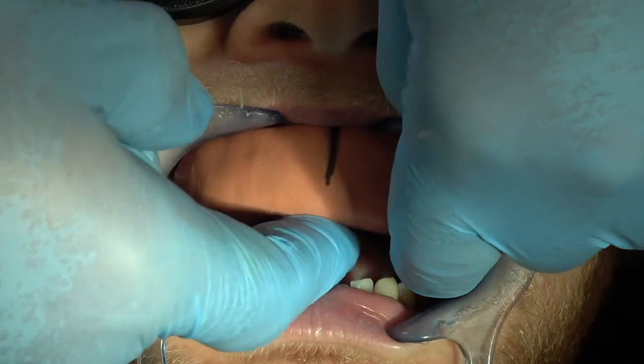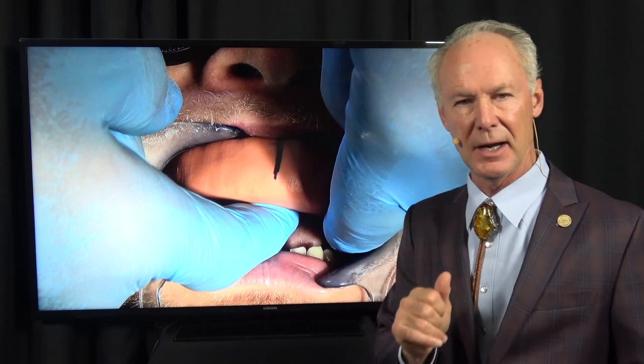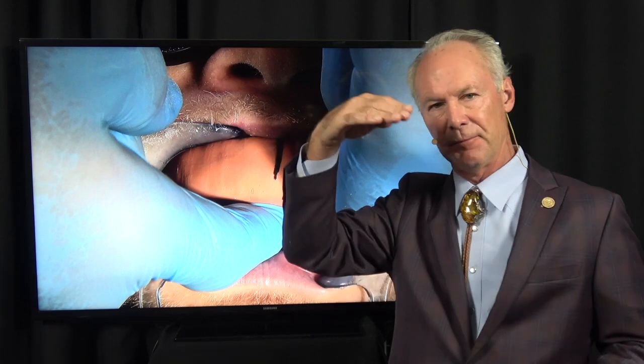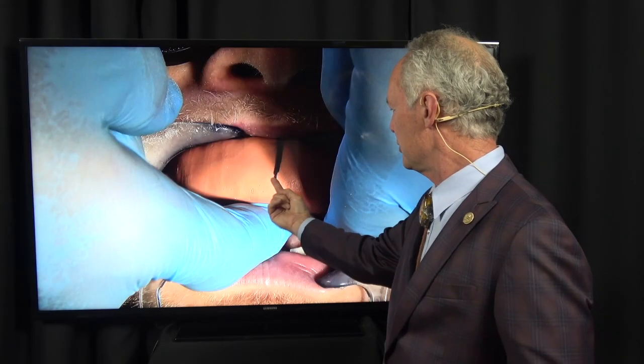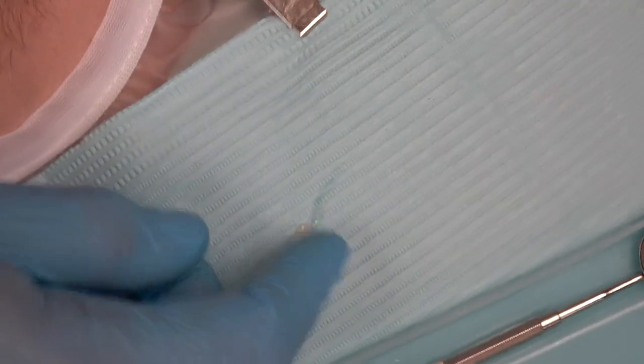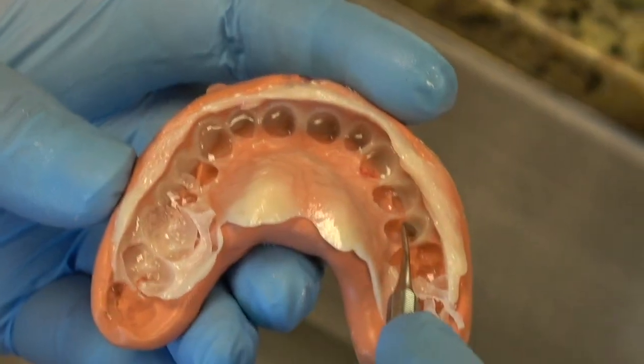Now, when you fabricate this matrix, it's very important that the matrix extend onto the palate. Because if you've prepared all the anterior teeth and you've reduced the incisal and you push there, the matrix will seat too much and you won't have any bisacrylate material on the incisal edges of the anterior teeth. If the matrix extends onto the palate, you can push on the palate and the palate acts like a stop for the matrix. Then squirt a little bit of the bisacrylate on the patient's bib so you can tell when it's set. Then just work it off.